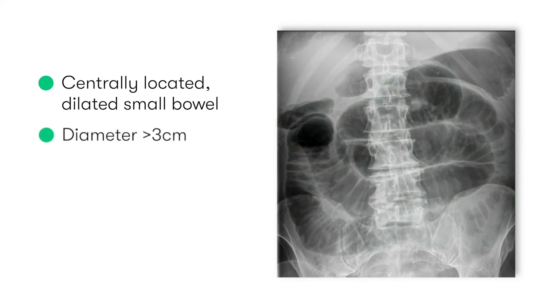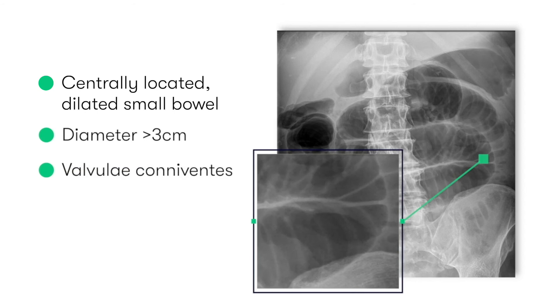We can tell that these loops of bowel are in fact small bowel rather than large bowel due to the presence of valvulae conniventes, which are near-circumferential folds of mucosa visible as lines that traverse the diameter of the bowel.